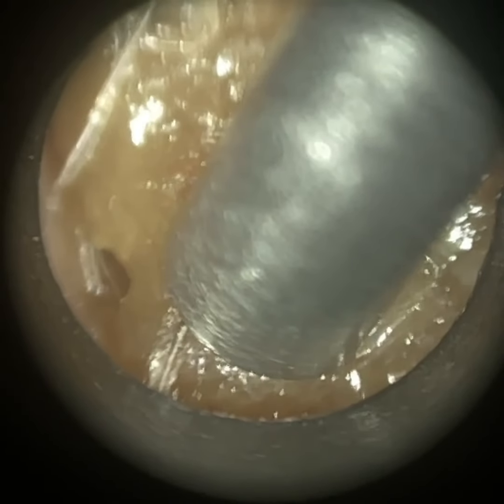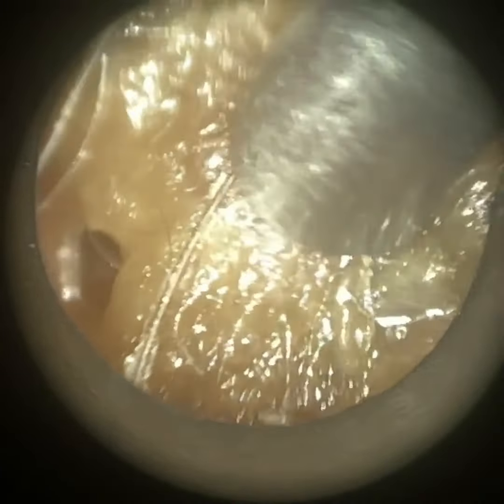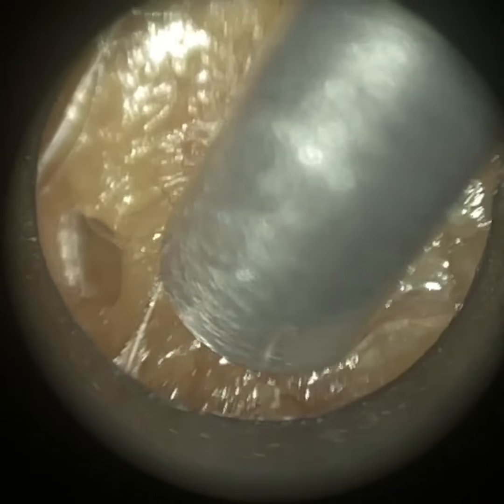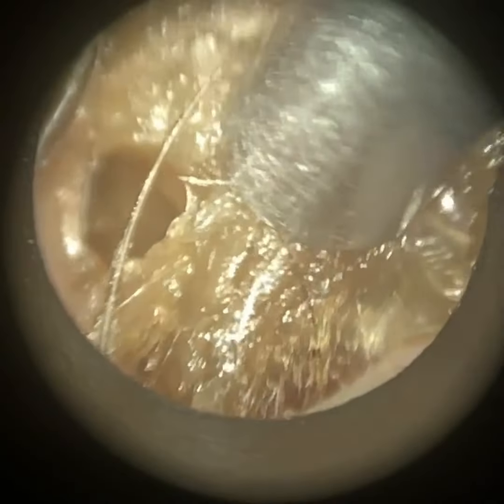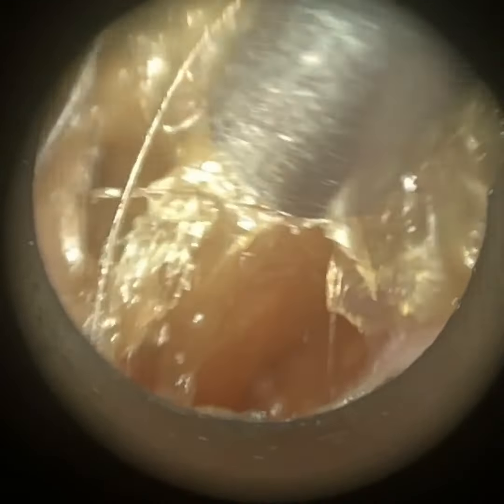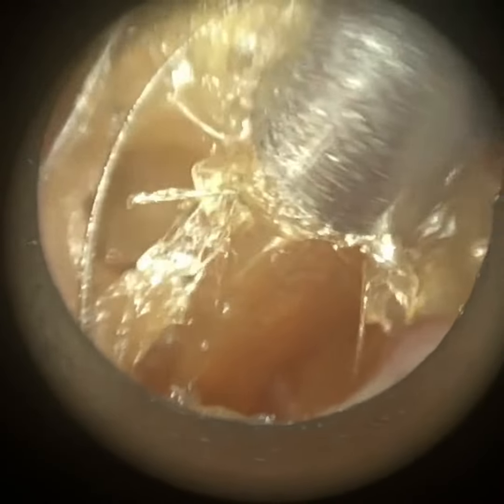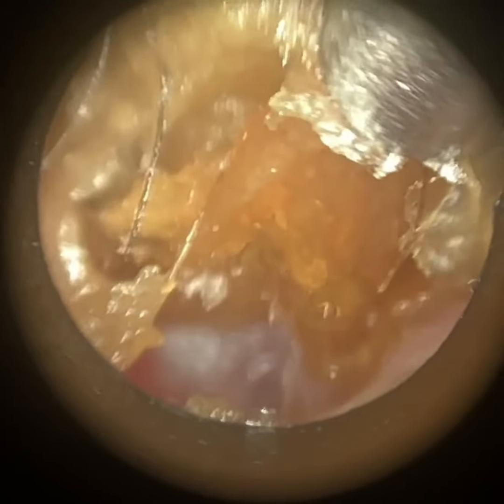This is the patient's left ear. This patient's wax plug in this ear is enveloped by this peripheral skin. I'm just trying to elevate this from the canal floor. It's quite sticky. This patient attends every year, so on my notes I've already documented that there's a bit of skin there. You can see that's the wax just below the suction probe and around the top hemisphere of the view — that's some skin. You can see the difference in complexion.